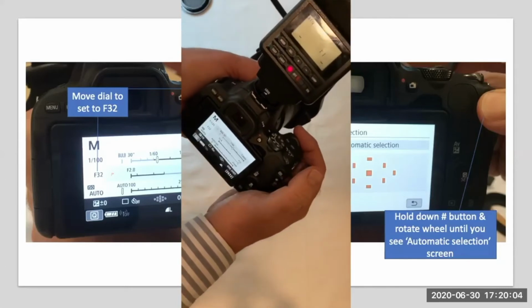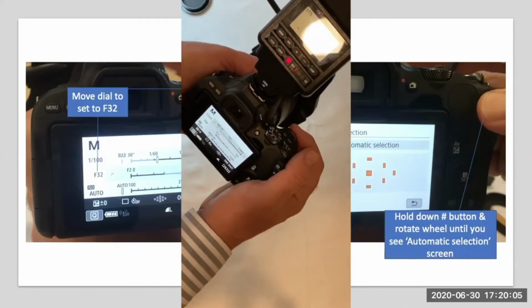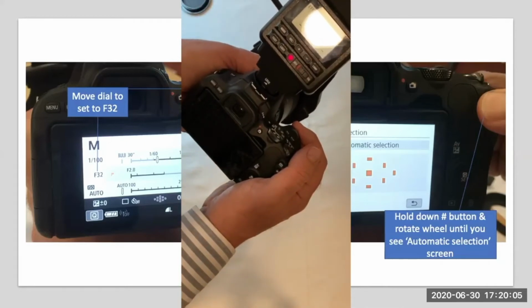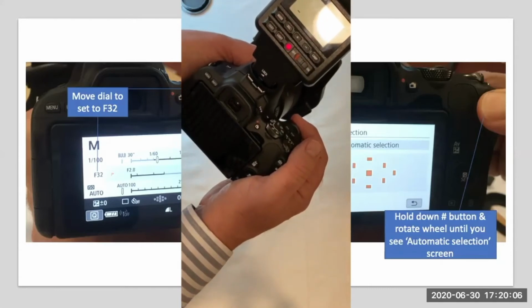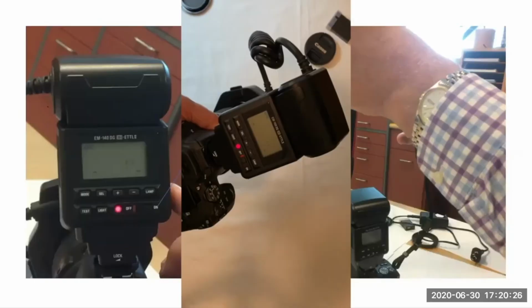And then when you've got something to focus through, look through the viewer, and you should be able to then focus on something. The camera, when it does come into focus, will beep and take the photograph, and takes a beautiful photograph.